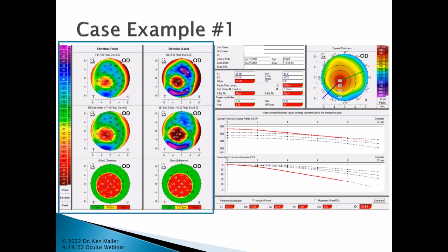And what those are is a manipulation of the data to highlight whether or not we're dealing with something that would be more like keratoconus or not. There's more information about how this particular screen works, but basically, because this is sort of exaggerating the keratoconic, if everything was solid green, you probably don't have keratoconus. But in this particular case, you can see we have both green and the red in the middle, and that's highlighting the fact that this most likely is keratoconus.